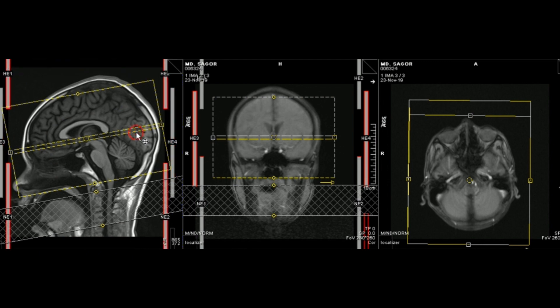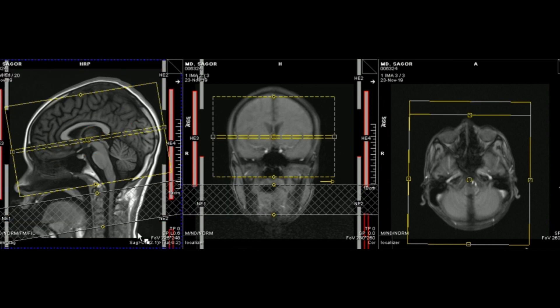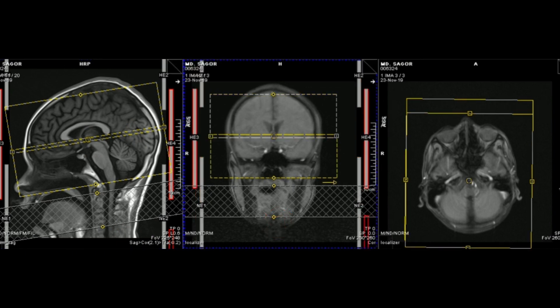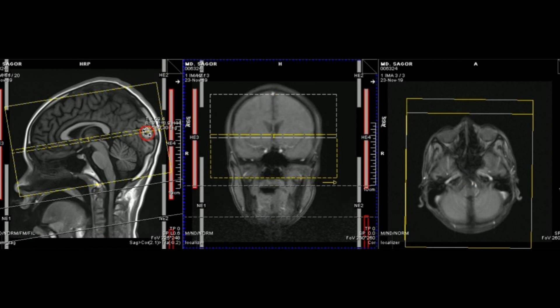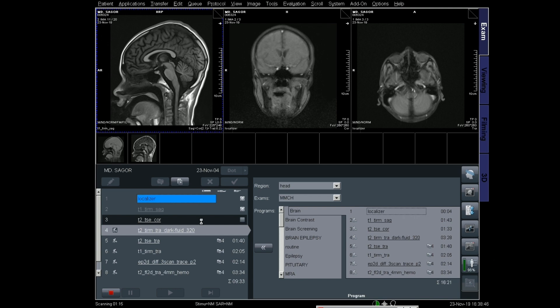Here is the sagittal image that I am planning — on the sagittal image, parallel to the corpus callosum and covering from the foramen magnum to the vertex. Also plan on the coronal image, and the slices should be perpendicular to the third ventricle and the brainstem.